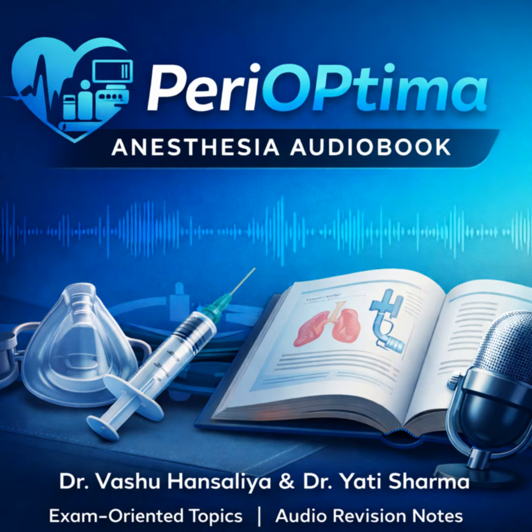However, if a cross-connection happens, the machine's preventative systems have failed. The O2 analyzer and the pulse oximeter become the absolute last line of defense, detecting the hypoxia only after the patient is already inhaling the dangerous mixture. So if we only relied on detection, the intervention would always be reactionary, not preventative. That's why robust engineering must always come before and complement vigilant monitoring.